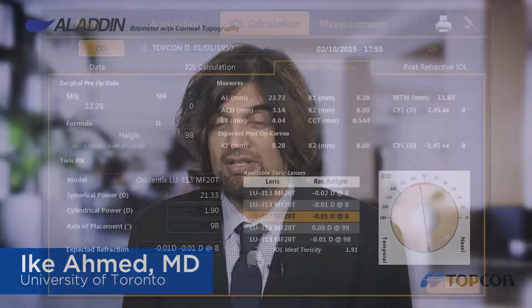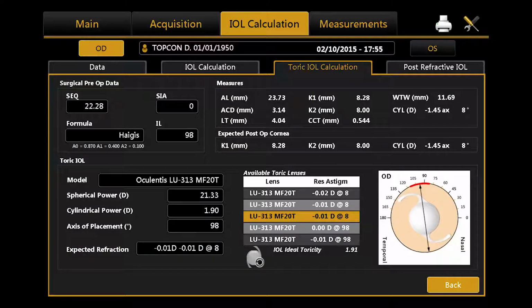One of the most annoying things that I do routinely, and our staff do routinely, is entering measurements manually on the website, calculator, or another software. Errors happen, workflow issues occur. So we love, of course, when calculators and formulas are built on the platform. I mean, this makes life so much easier, reduces errors, and gives us, again, one-stop measurements and one-stop calculations and one-stop printouts. So I can't tell you how valuable that is. There's obviously a lot of reasons why having one platform to do everything is helpful, but that alone is a feature for me that I think is very, very useful in terms of all the reasons we talked about.